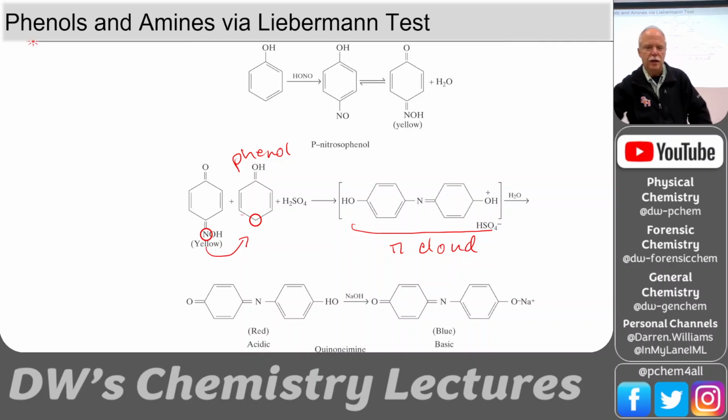Okay. So this one is acid base. This basically makes an acid base indicator. It's red in acid and blue in base. Okay. And this would be a carbonyl dye because you've got the n to pi star transition.